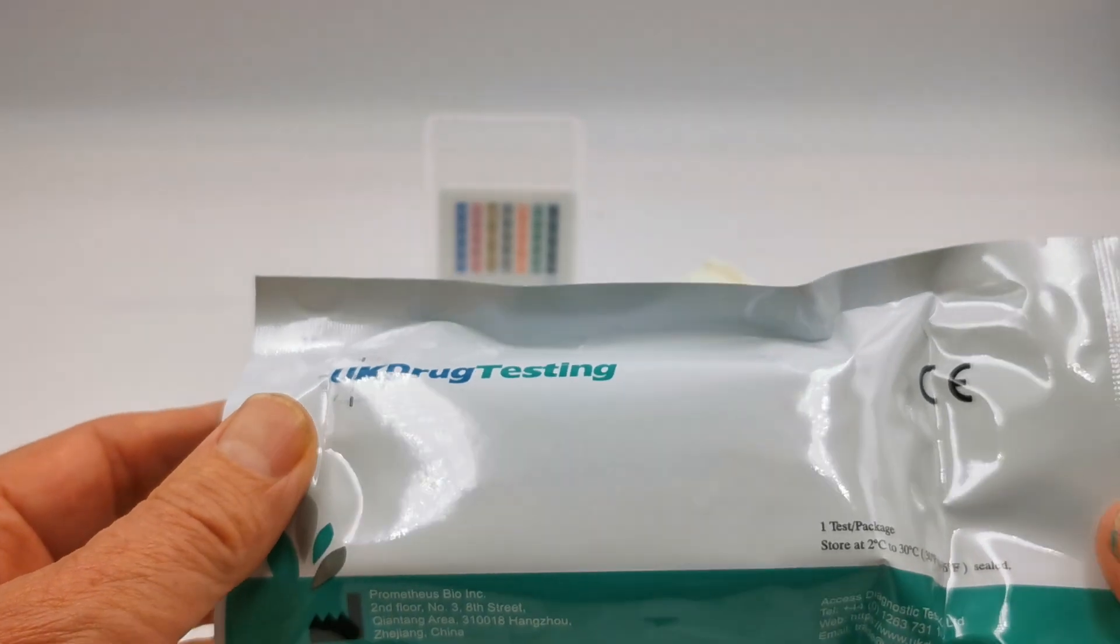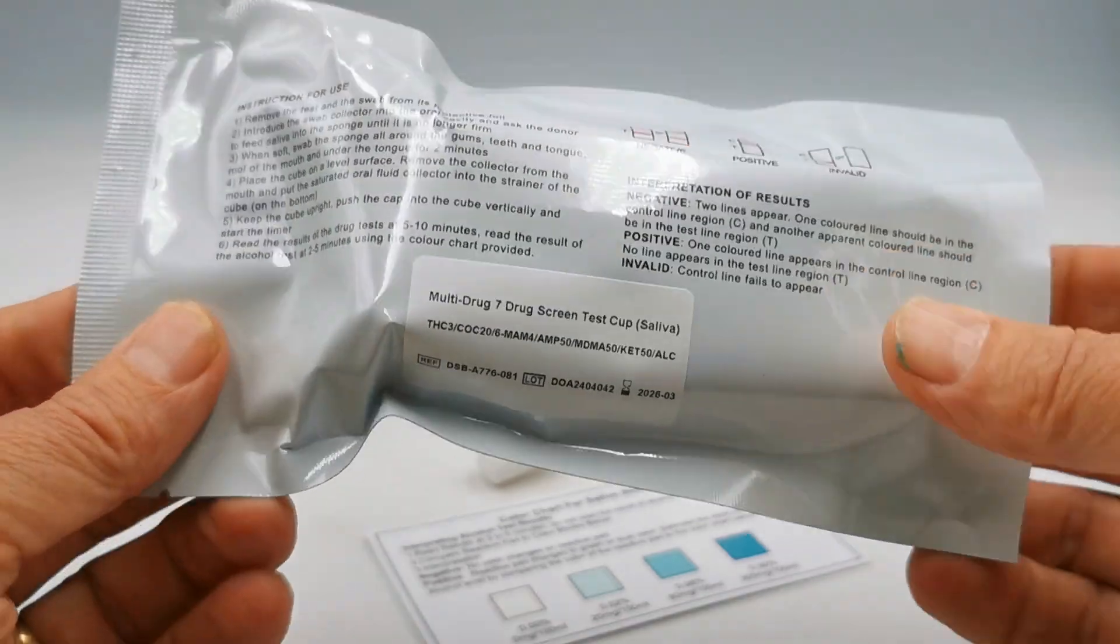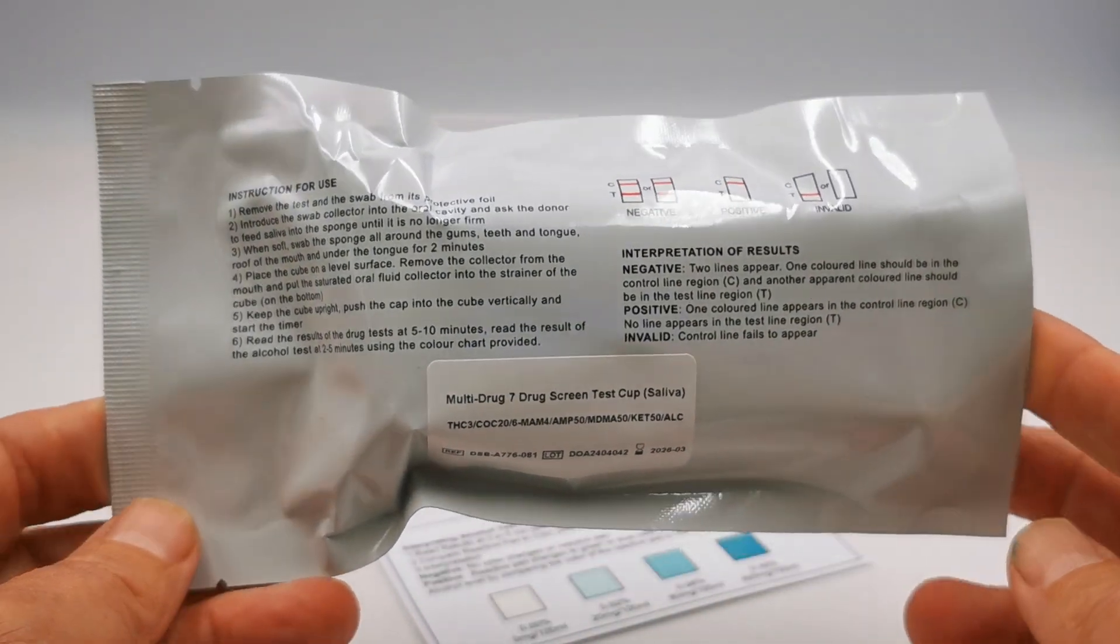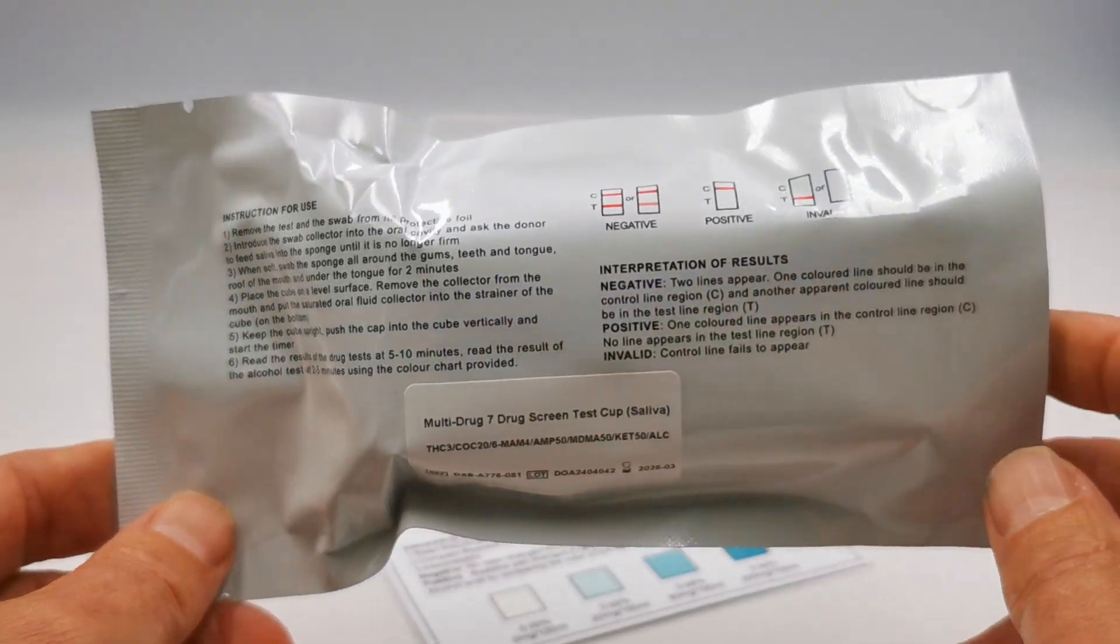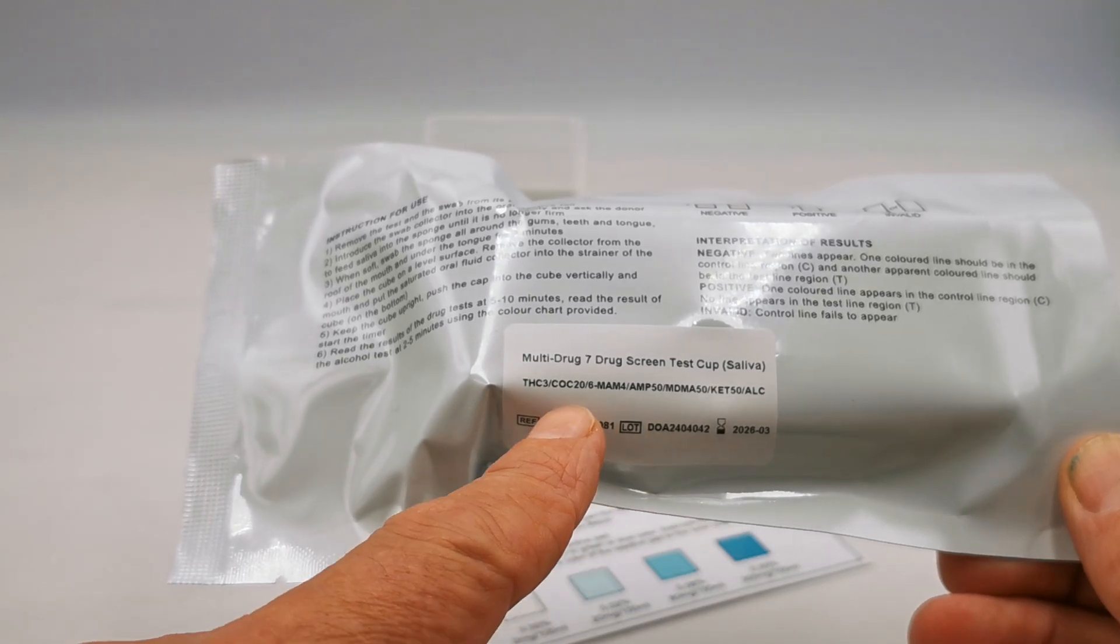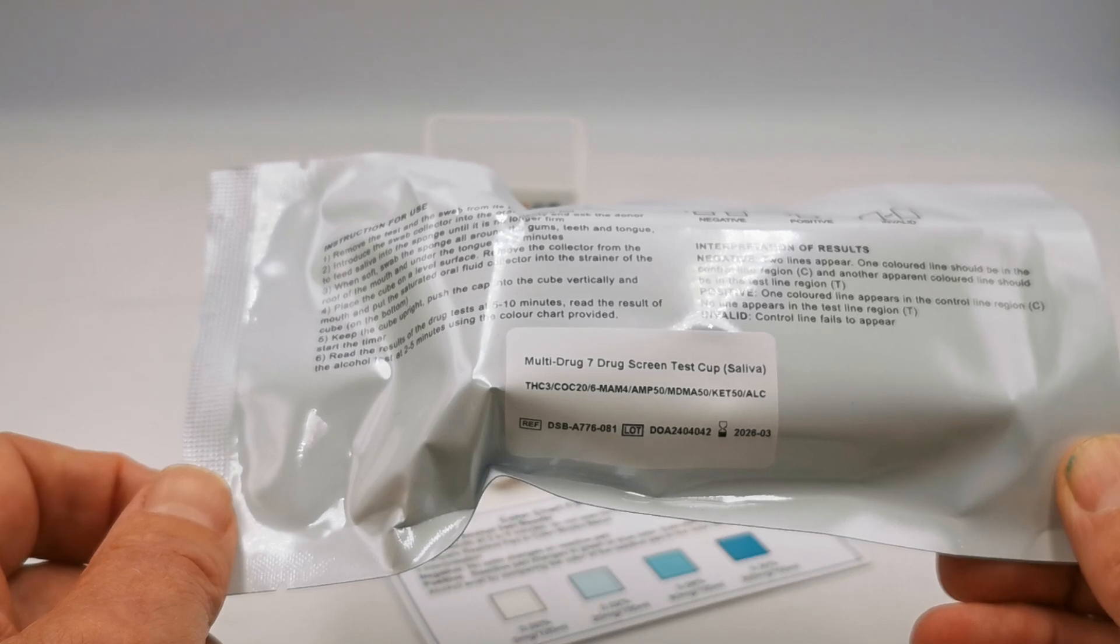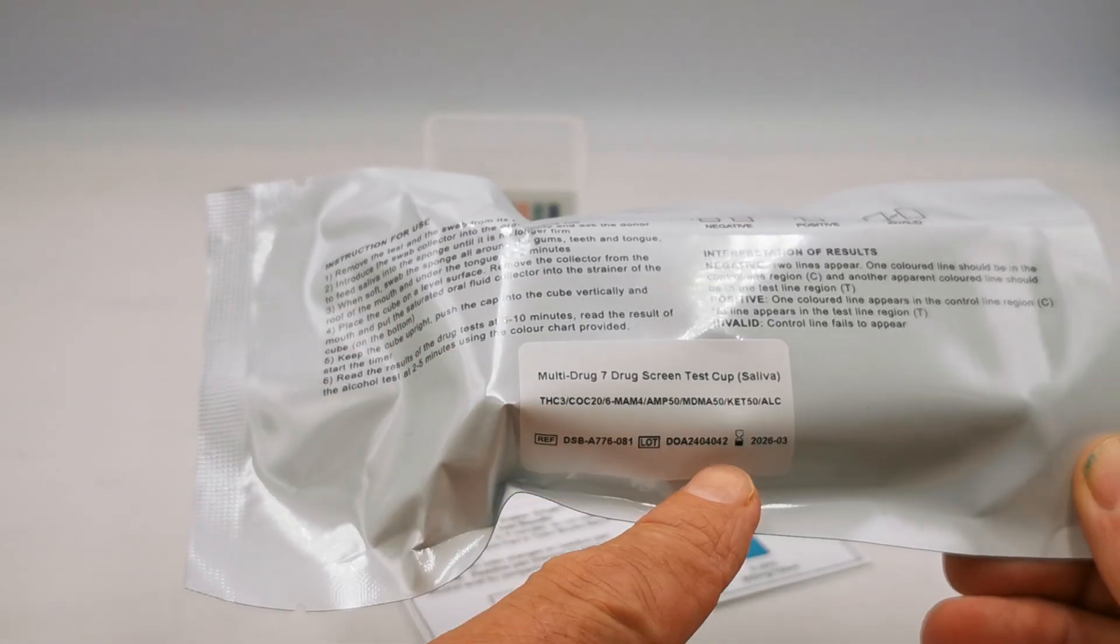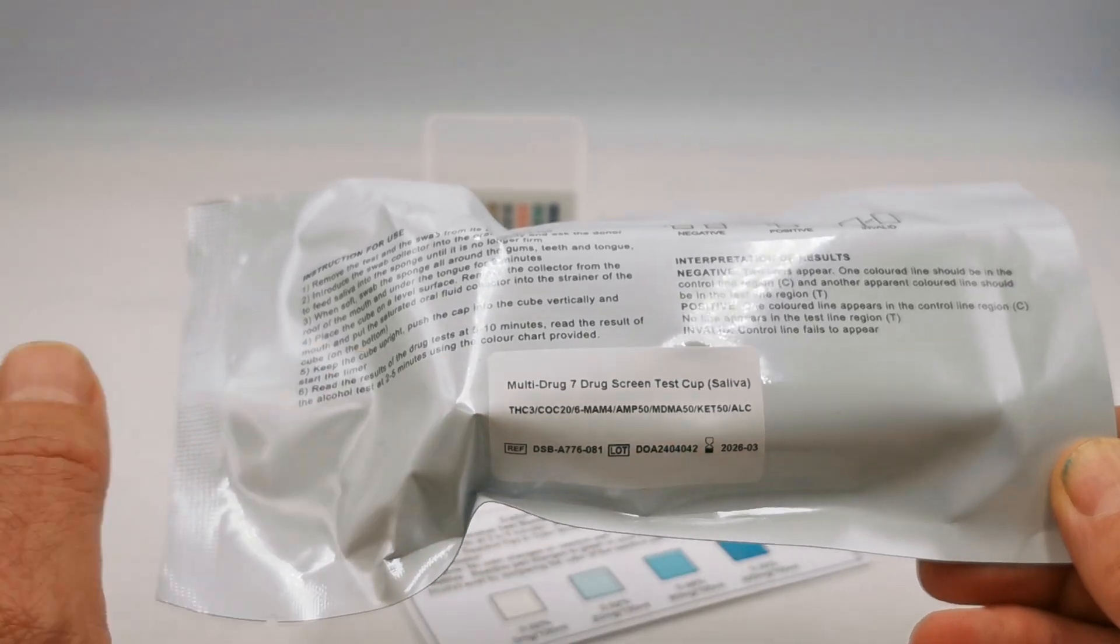UK Drug Testing CE mark foil in our standard colors, and on the rear we've really gone to town to make sure that you've got a full set of instructions both in terms of how to run the test and how to interpret the results. There's also a sticker here giving you the combination and cutoff sensitivities for each of the six drug groups plus alcohol with the code numbers, lot numbers and batch expiry date.